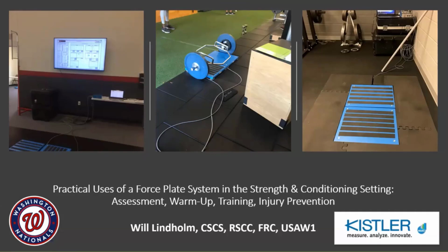And how we can apply the data we got in a simple manner to educate people who aren't quite familiar with all the data, and be able to apply it right away to get the best results for our athletes on a quick matter, so we can get our guys back to playing right away or increase their performance right then and there.